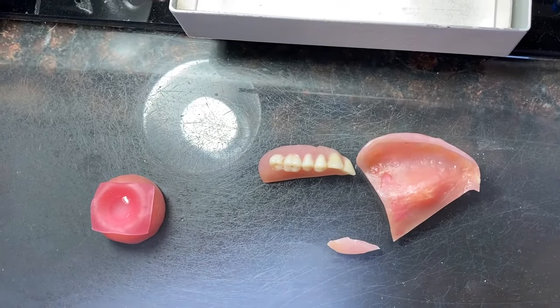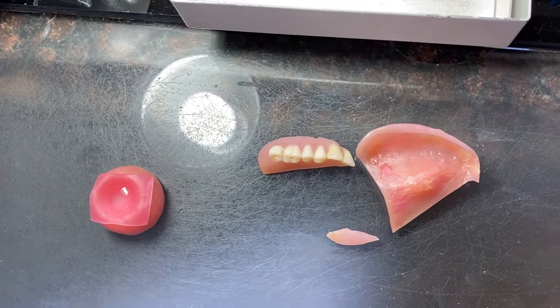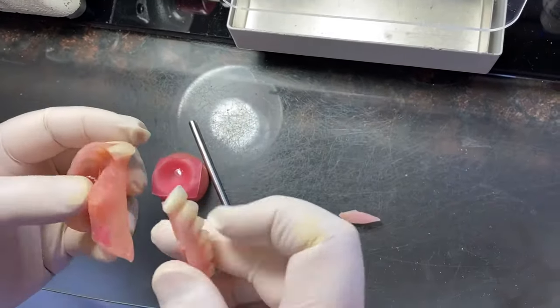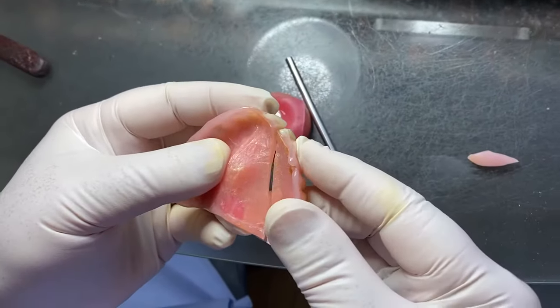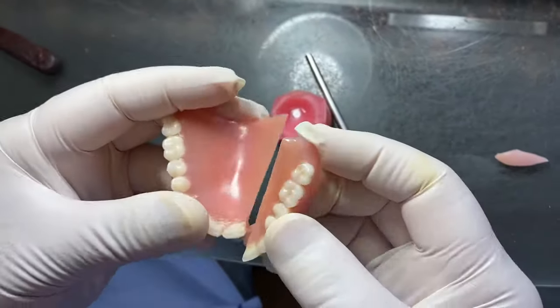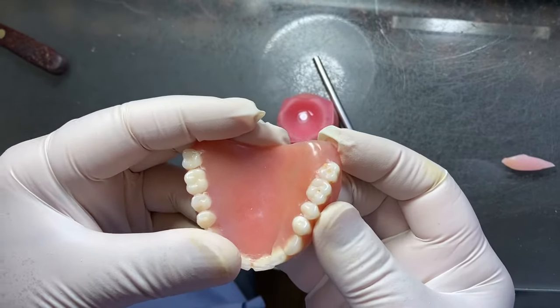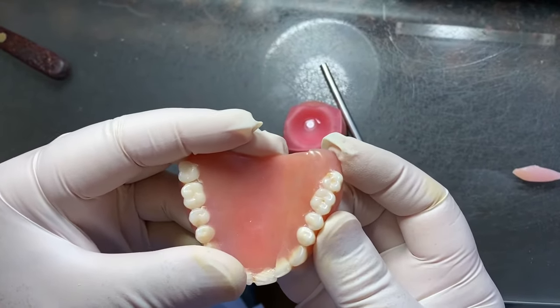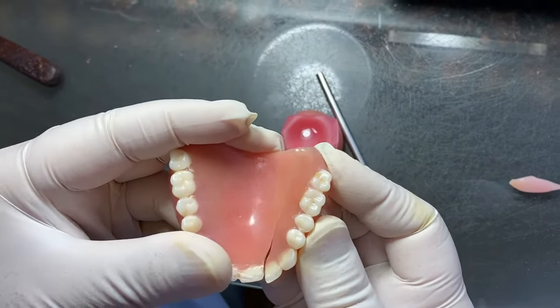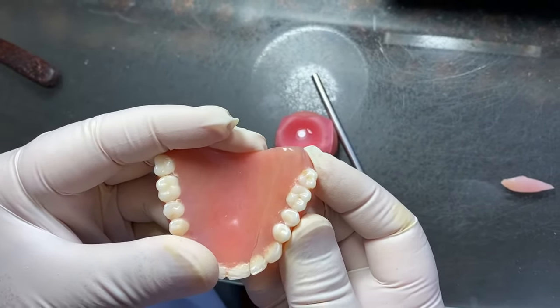Then you take something like this. Before that, you have to practice without glue — to fit, very good, see? Practice how you can fit it. It's very difficult. You practice it to how you're fitting.